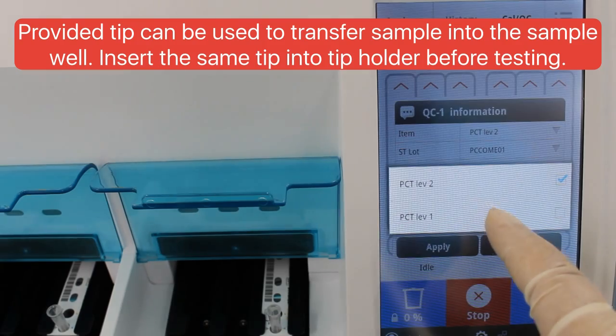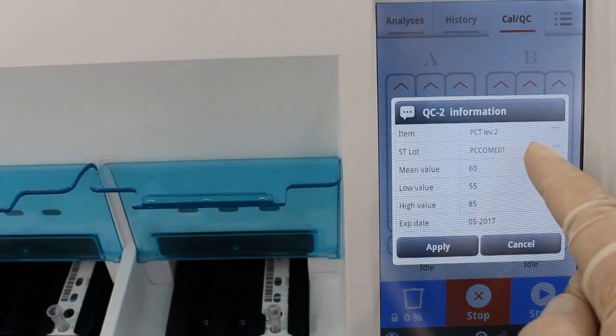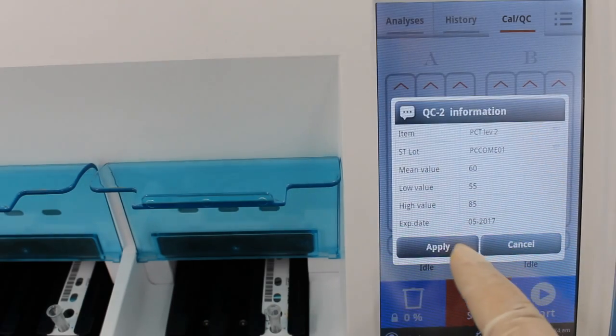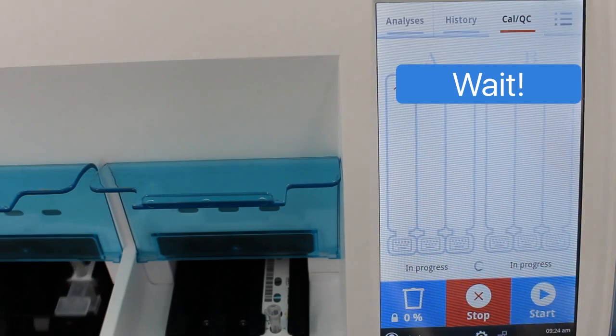On screen, apply the control information on channels 3 and 6 as shown. Then press start. Check and then confirm start.